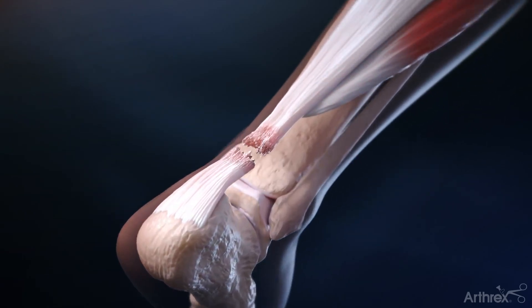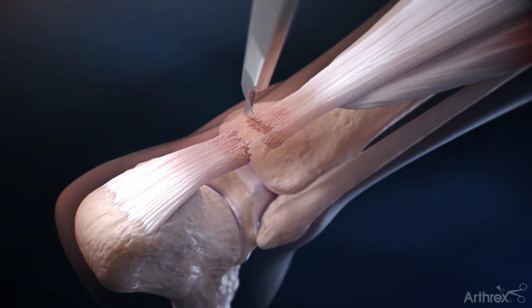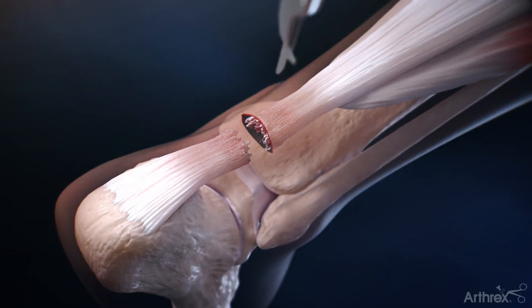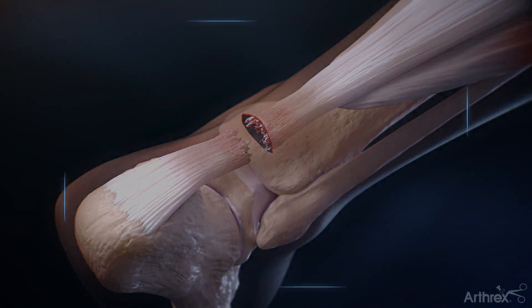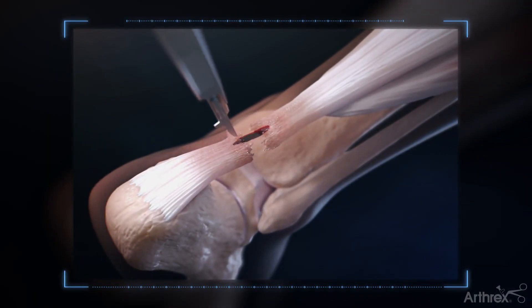When using the PARS jig for the Achilles mid-substance speed bridge technique, a percutaneous incision is made in a transverse manner just proximal to the palpable rupture. Alternatively, a small longitudinal incision can be utilized.